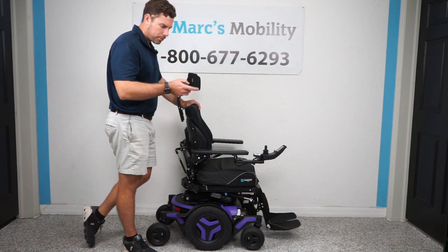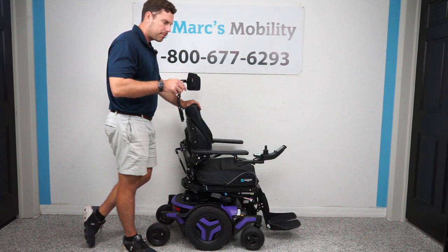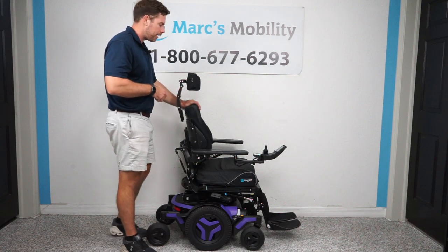Permobil does make a front-wheel drive and a mid-wheel drive. Mid-wheel is best for inside or outside on paved surfaces. Front-wheel drive can still be used inside, but it is a lot better on non-paved surfaces for outside.